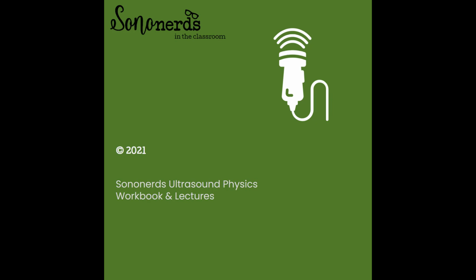In general, if we look at the phased, the linear sequential, and the vector transducers, the phased transducer uses all of its elements, uses electronic patterns to steer and focus the beam. The linear sequential transducers use sequencing to create the full field of view. They use electronic focusing and are capable of phasing if wider views are needed or if we turn on color or pulse wave Doppler.